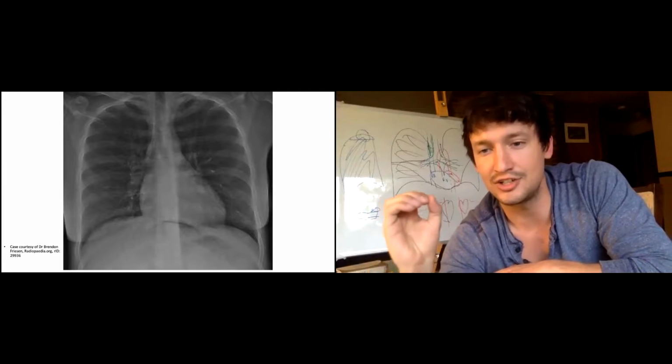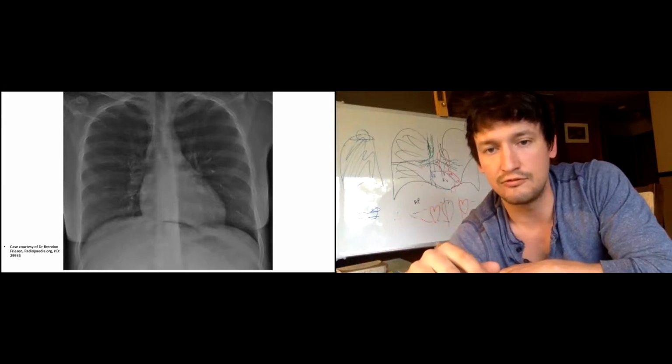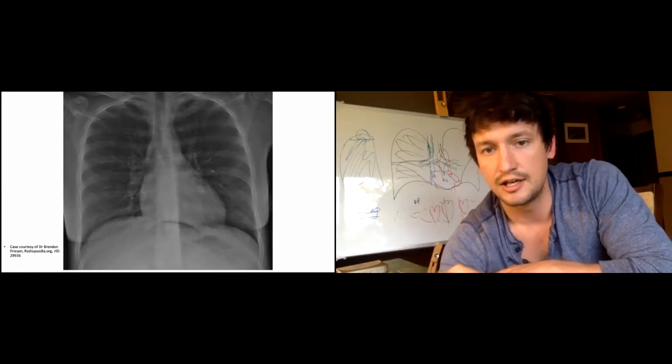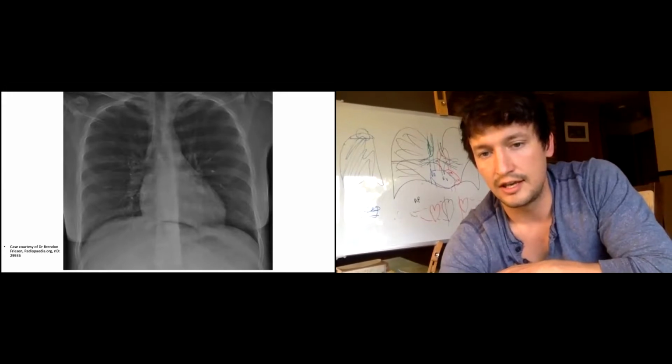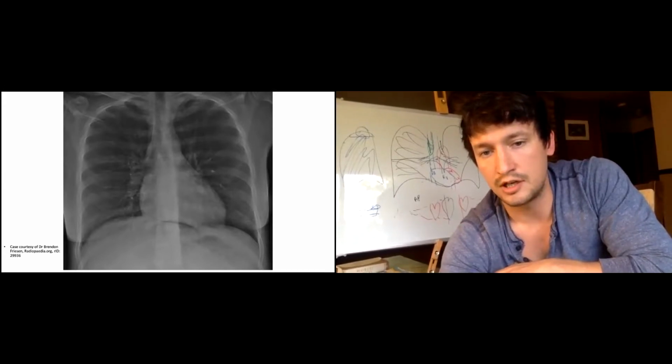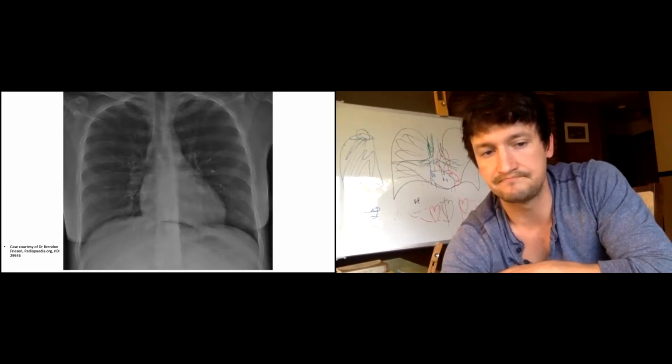Yes, that is perfect. You can also sometimes see air that outlines vasculature, or air that's dissecting up the neck. And sometimes another sign of it, if it gets really bad, is a lot of subcutaneous emphysema. So perfect. This is like a continuous hemidiaphragm. But you shouldn't be able to see the air under the heart. You should have a silhouette sign right there because the heart is sitting on the diaphragm. Next slide.